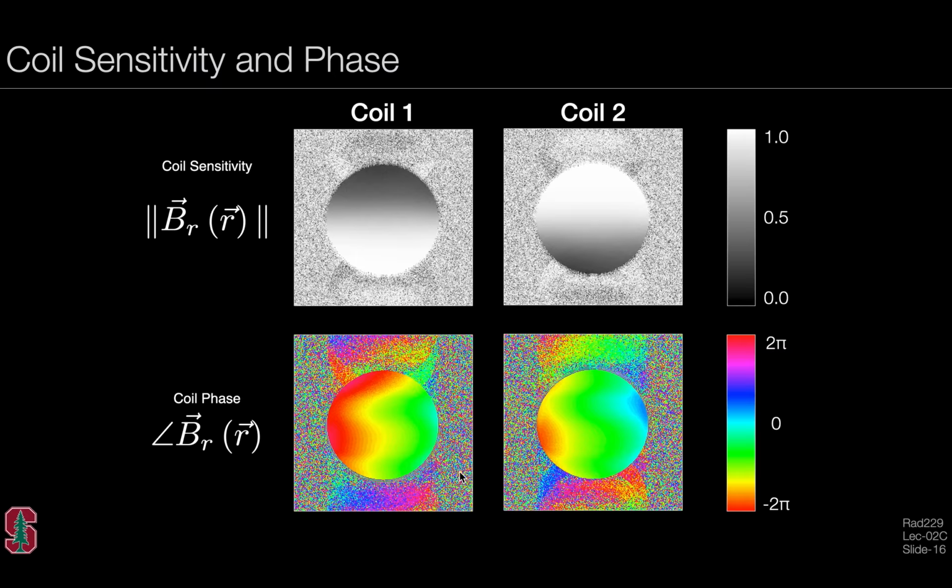And so depending on the specifics of the imaging information that we really need to reconstruct, we may or may not care about the coil sensitivities or the coil phases themselves.